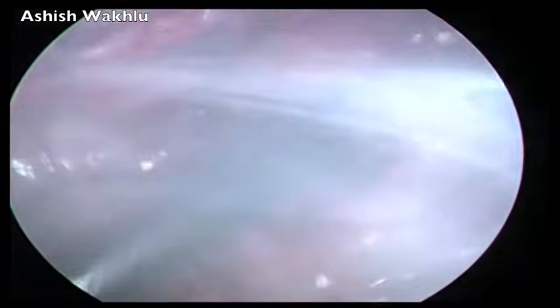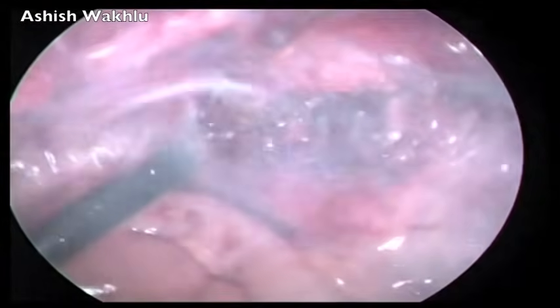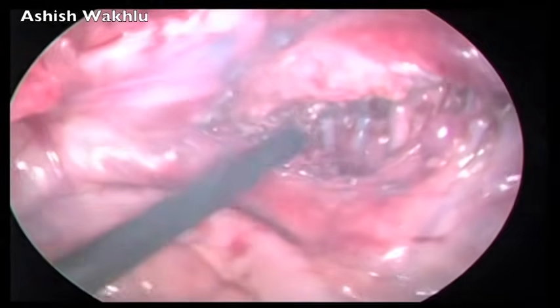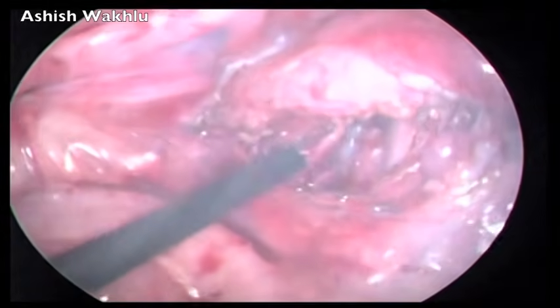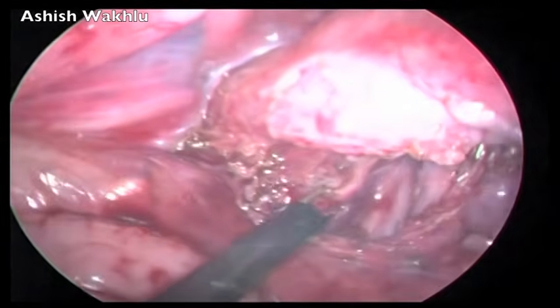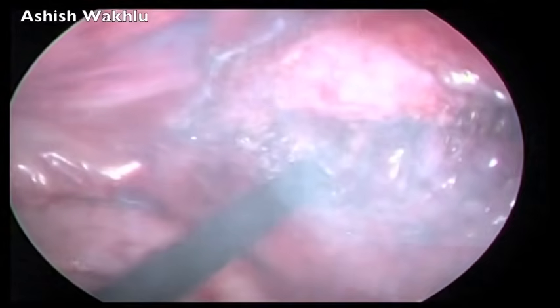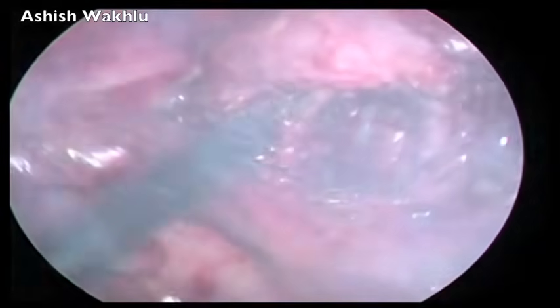It's now possible to appreciate the thickness of the mesentery which occurred due to the bowel dilatation in this patient. However, we can see that the actual fistula is quite narrow, and it was only the thick mesentery which was making it appear large in diameter.